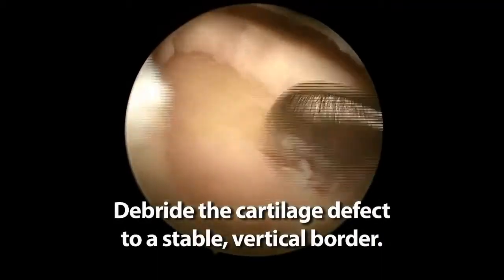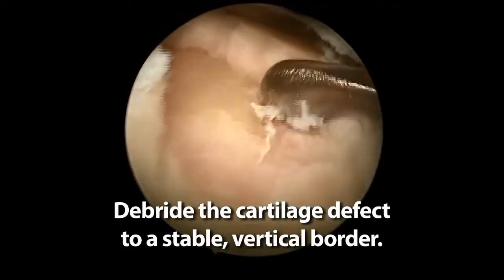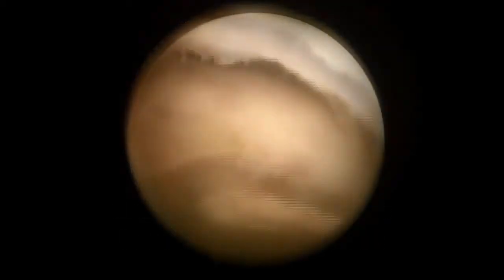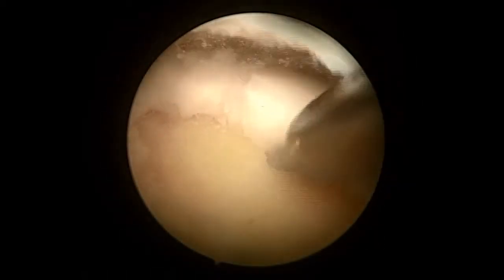The cartilage is then debrided further and vertical walls are established. A shaver used on forward can help create vertical walls. Following this, a power pick is utilized to create the microfracture holes.